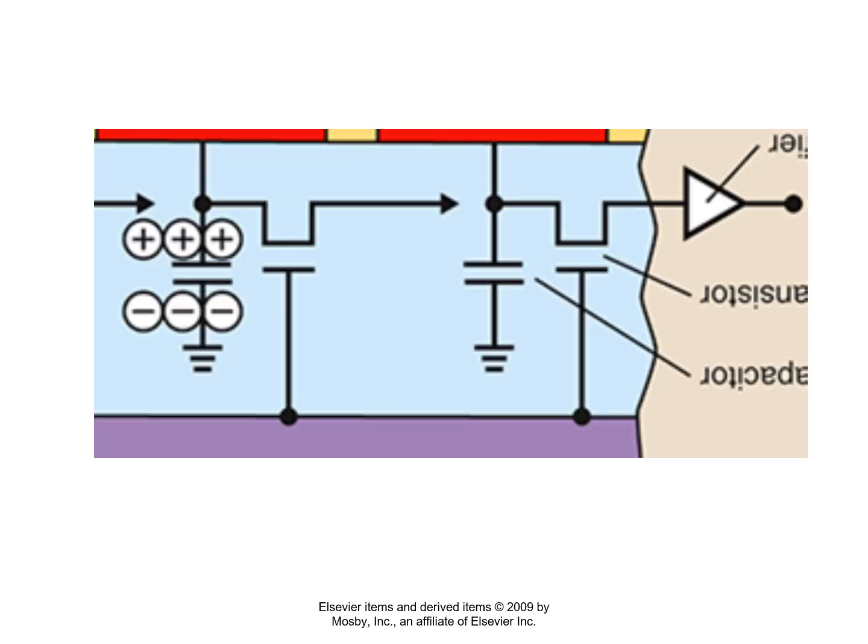All right, so this part here, from left to right, there's the full storage capacitor with a grounded negative plate. So the ground is donating those electrons just for the sake of parking those positive ions and holding on to them. That's why it's called the storage capacitor for that particular pixel gate electrode, which is the red. Okay?